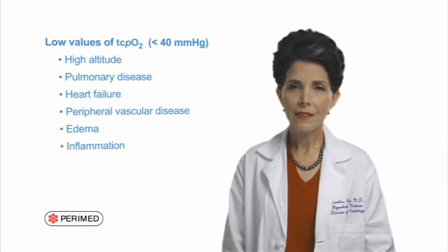A best practice suggestion is to check the patient's oxygen saturation using pulse oximetry to ensure that arterial hypoxemia is not the reason for a low TCPO2 reading.